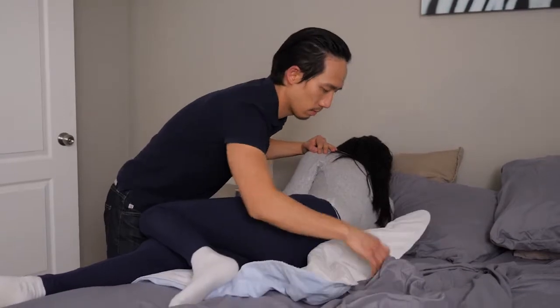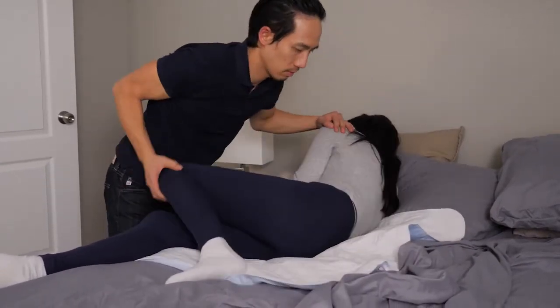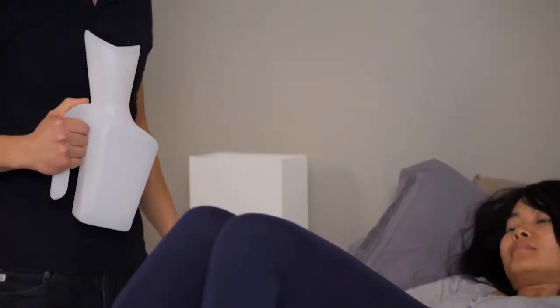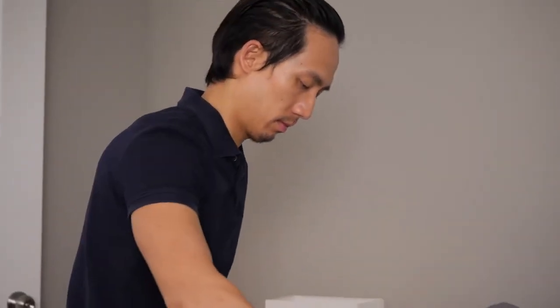A urinal is a bottle with a handle made to urinate in. To help someone use a urinal, put a towel or waterproof bed pad under them and help position the urinal so that urine can easily flow into the bottle. It may help to have them lay on their side if laying on their back doesn't seem to be working well without spilling.